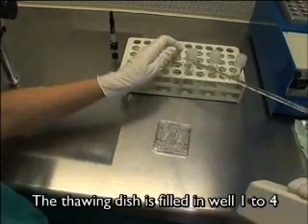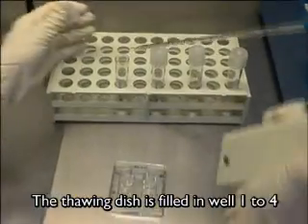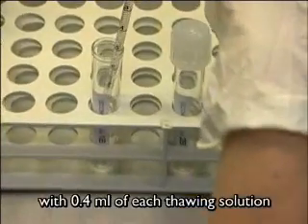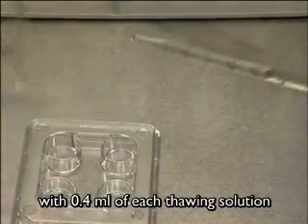The thawing dish is filled in wells 1 to 4 with 0.4 milliliters of each thawing solution. The thawing dish is allowed to equilibrate at room temperature prior to the thawing procedure.